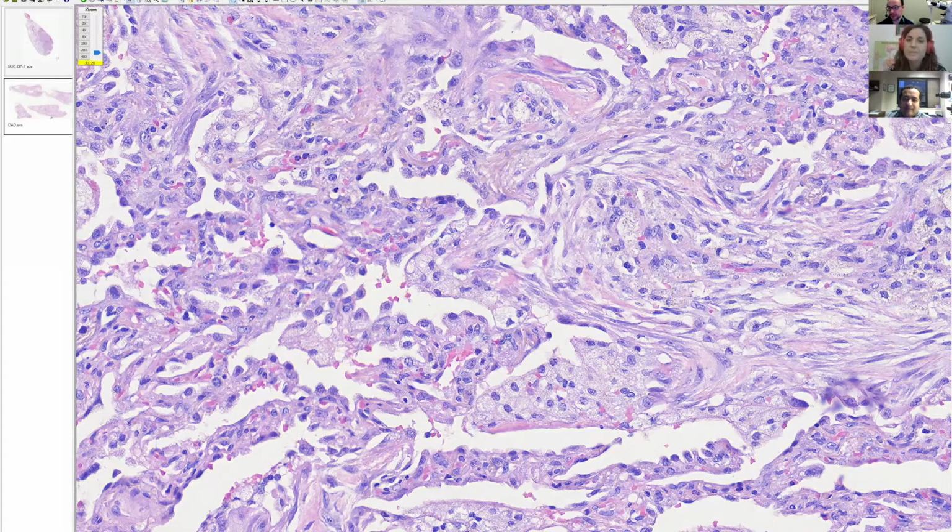Have you seen this? Yeah, I have. Like in the cicatricial variant of organizing pneumonia, or maybe if you have a pneumonia and you take the biopsy some months later, it doesn't mean that it's going to be. But I see it sometimes more collagenized, and I don't think that this is so talked about or so well known. Mm-hmm. Yes, that's true. There's a paper from Dr. Yousem about that cicatricial organizing pneumonia thing. But I think it's just describing exactly what you said, Irene. It just turns a little bit more collagenous with time.